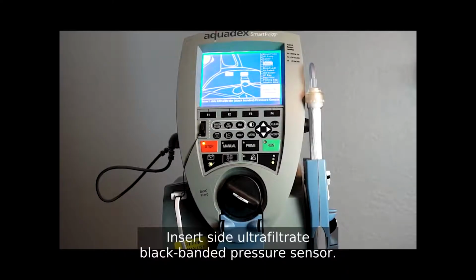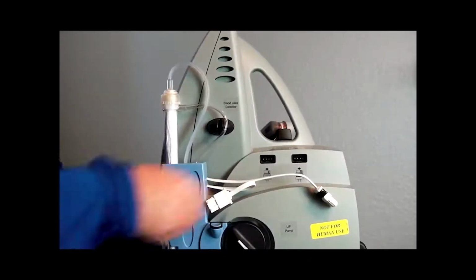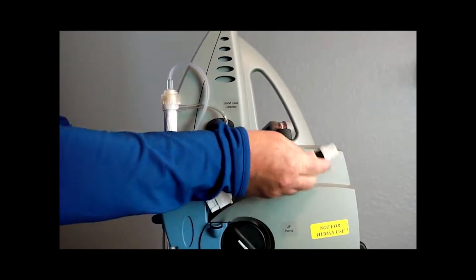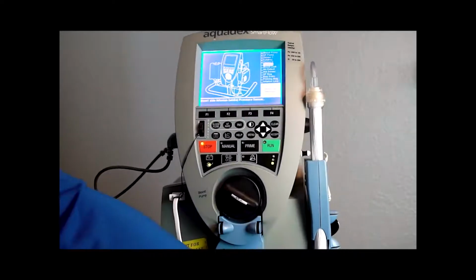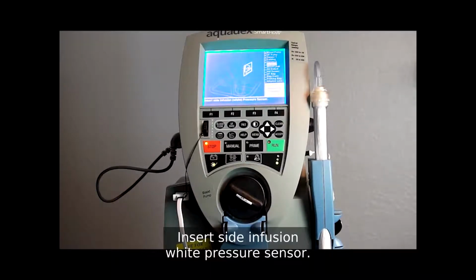Insert side ultrafiltrate black banded pressure sensor. Insert side infusion white pressure sensor.